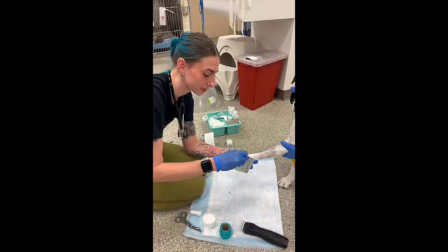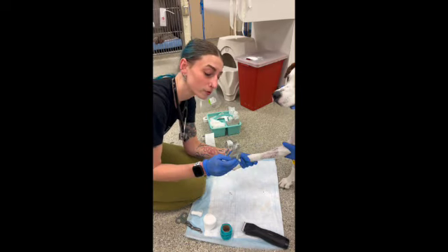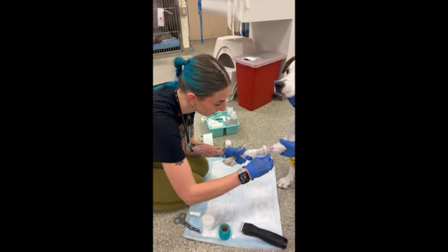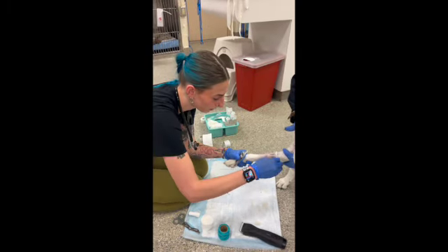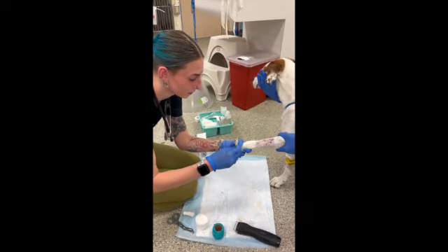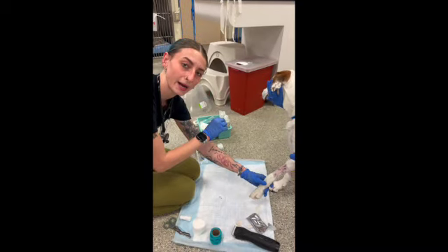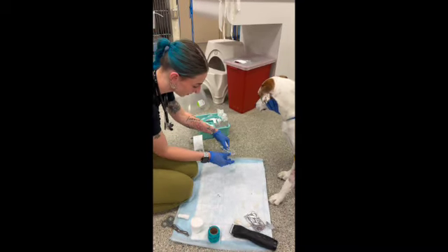And then now I'm just going to take my ChloraPrep and isopropyl alcohol swab sticks, and I'm going to swab the vessel 3 separate times. And I like to use the front and the back of each one just to help with extra cleanliness. All right, sweet girl. While that dries, I'm just going to prep my T-port and get my catheter ready. So I have an 18 gauge here that I have already got ready.